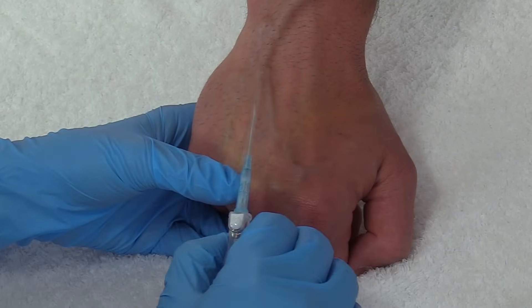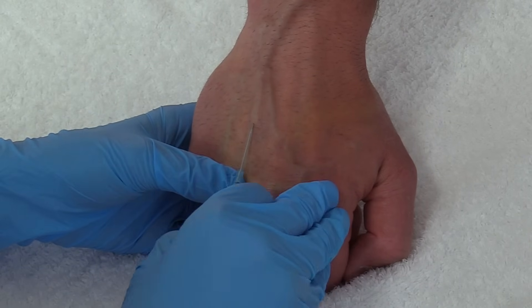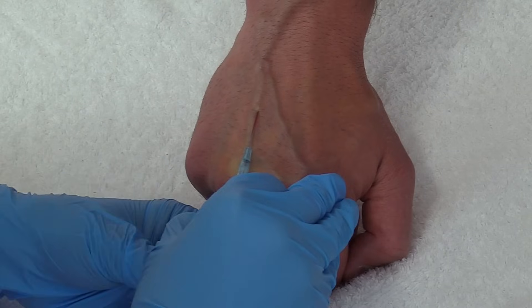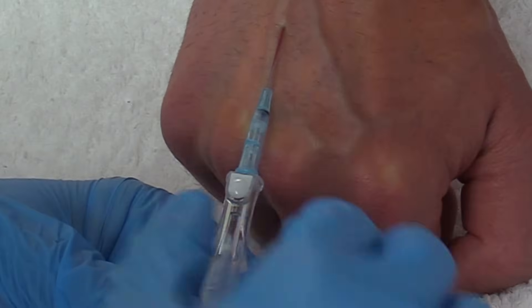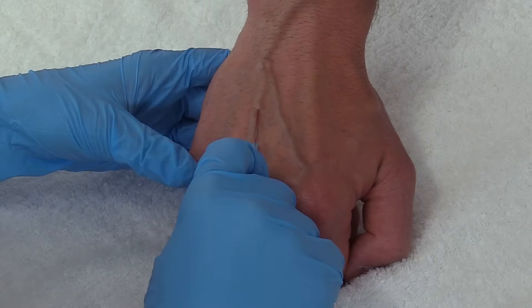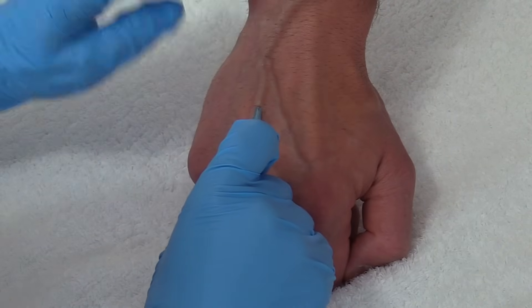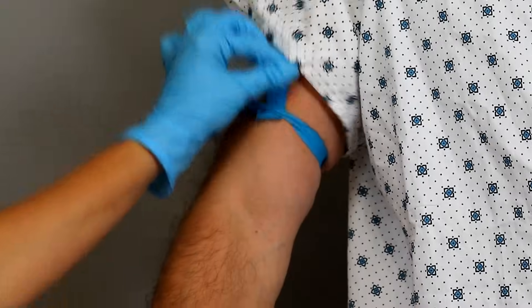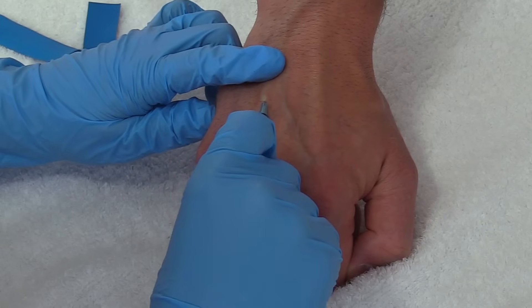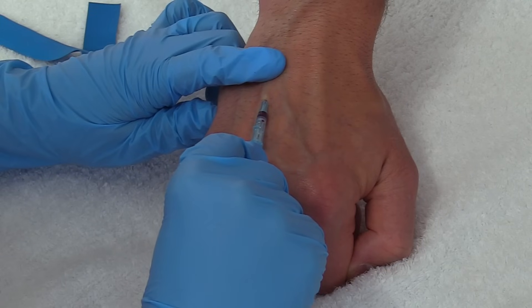Okay, here we go — you're going to feel a sharp stick. I have blood return and you can see that in the chamber right there. Now I want to go just a hair bit more. I'm going to thread this off — it's in there. Now after that I want to pop the tourniquet and take my finger and apply firm pressure because I don't want it to leak out. Then I'm going to hit the safety button to remove the needle and connect the access device.